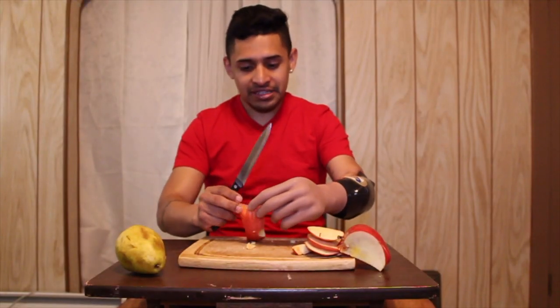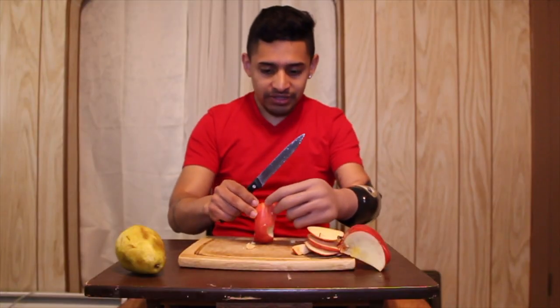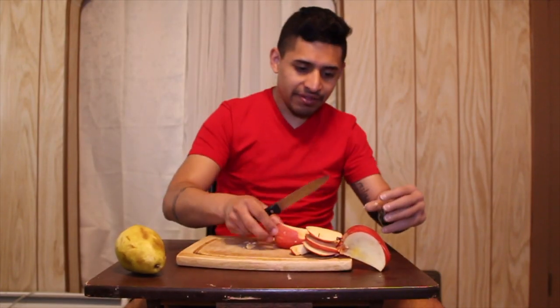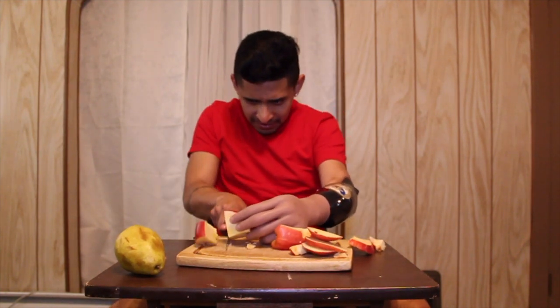I might grab it like this. Don't slip, it's slippery — come on, grab it, grab it. Never mind, I'll grab this.